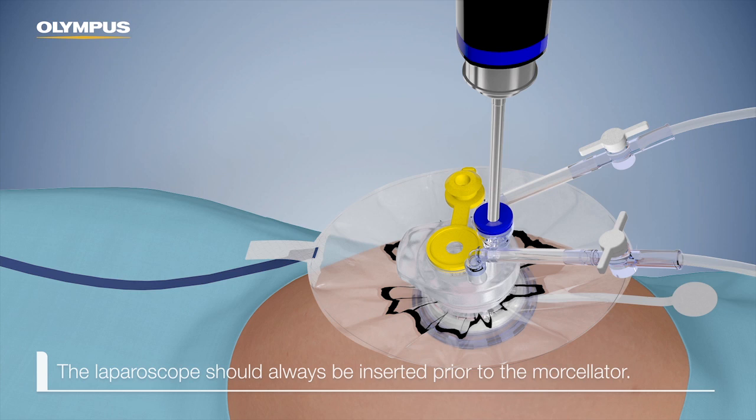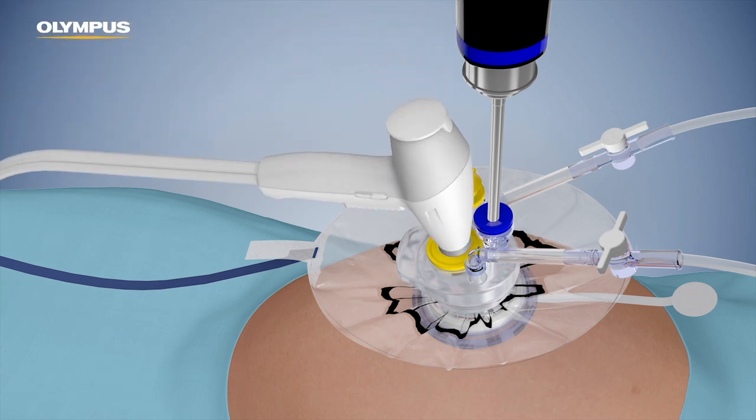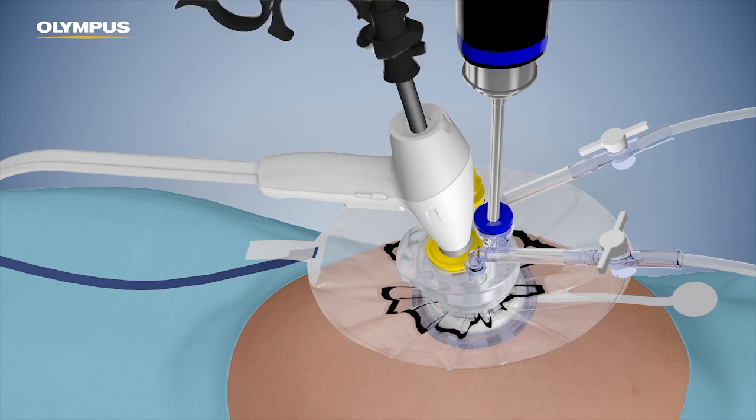The laparoscope should always be inserted prior to the morcellator. Once the scope is in place, insert the morcellator containing the obturator through the yellow valve. The obturator must always be used prior to the insertion of the morcellator into the pneumo liner. Remove the obturator and keep it in the sterile field for possible reinsertion later. Insert the claw forceps or the tenaculum with the jaws closed.